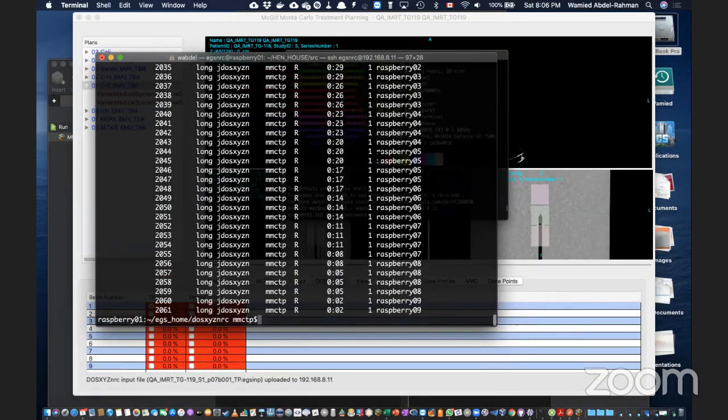That's why you need to have... I'm wondering, if I ran the same number of particles, let's say on my virtual machine, how long is it going to take? Because that will tell me the equivalence of my 13 Raspberry Pis to the 8 cores on my laptop's CPU, because the cores are faster on my laptop than the Raspberry Pis, but that is interesting.